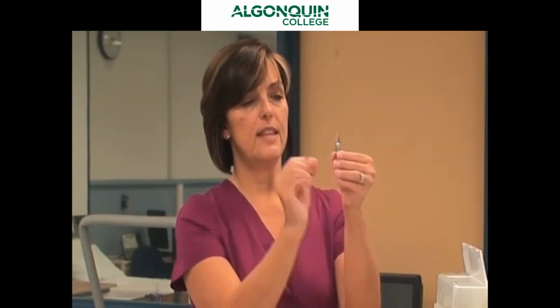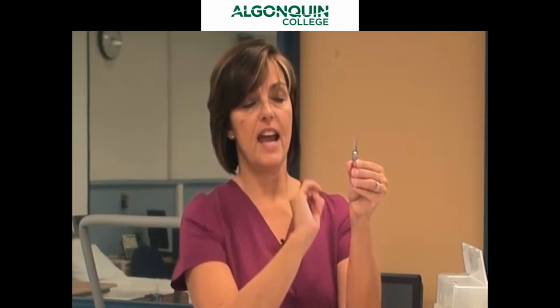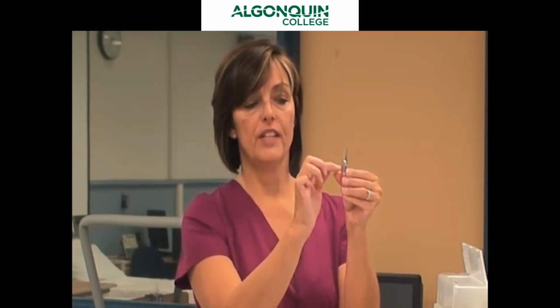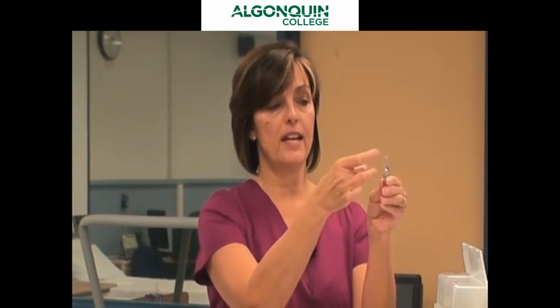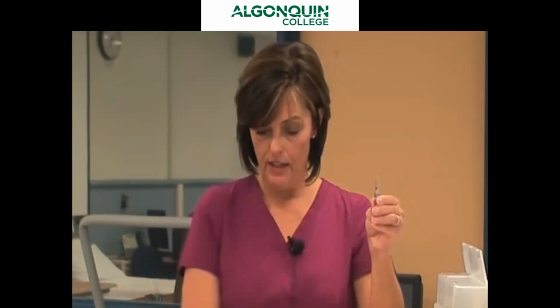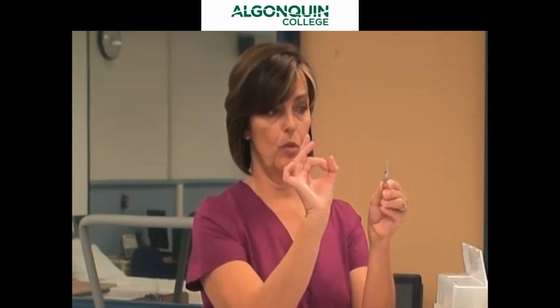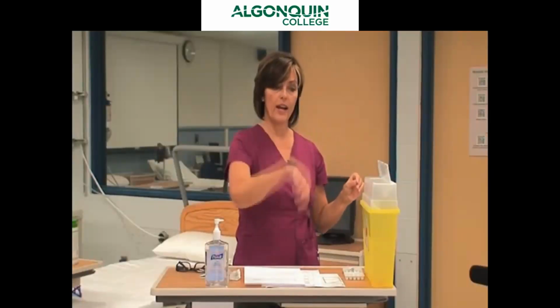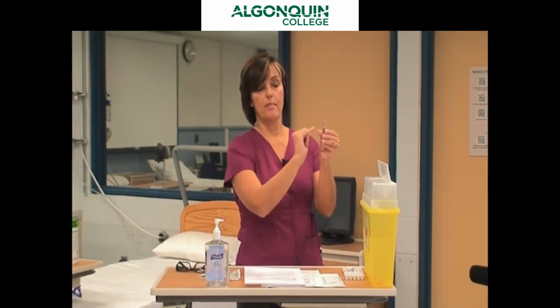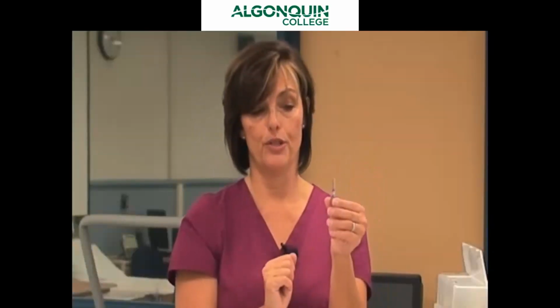If you can see, there is some medication up in the neck of that ampoule of Gravol, and we want to make sure all of it is in the bottom portion before we break open the ampoule. One way to do that is to flick the ampoule. You can use a pen if you don't want to use your finger, or another way is to shake the ampoule so that the medication goes down to the lower portion.